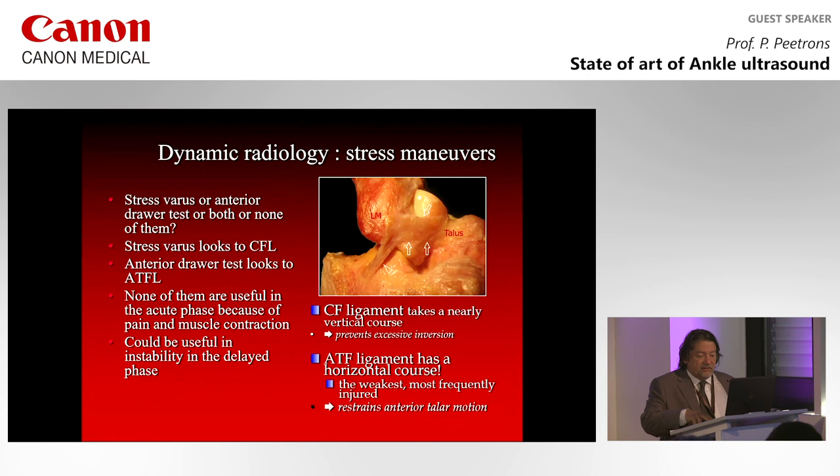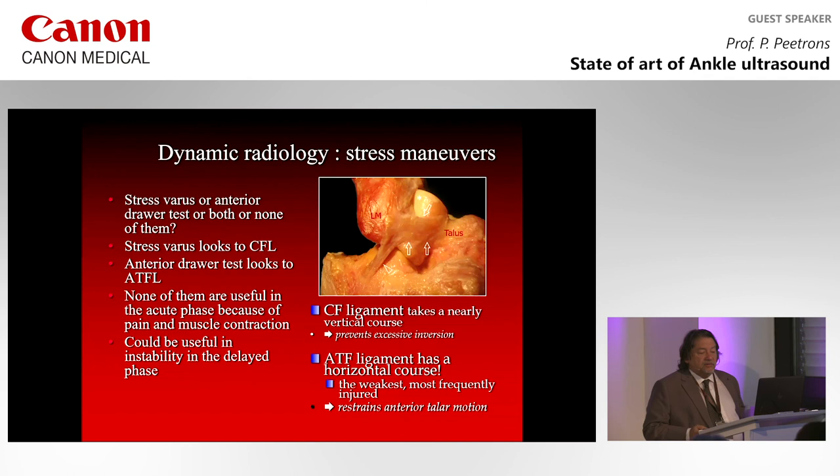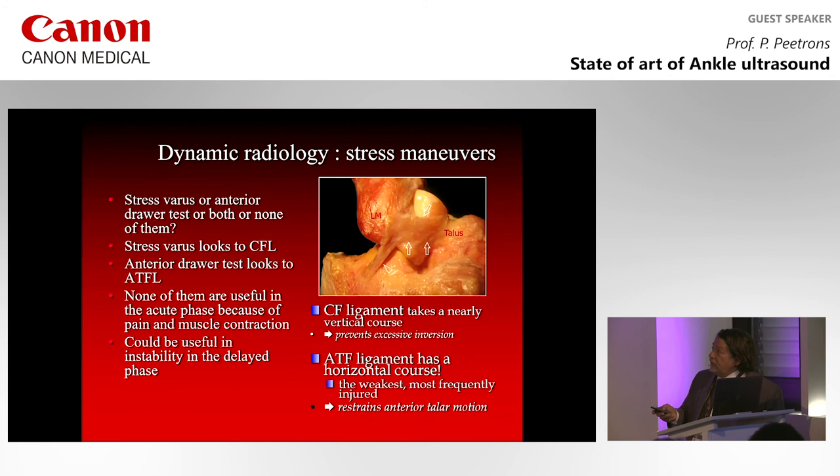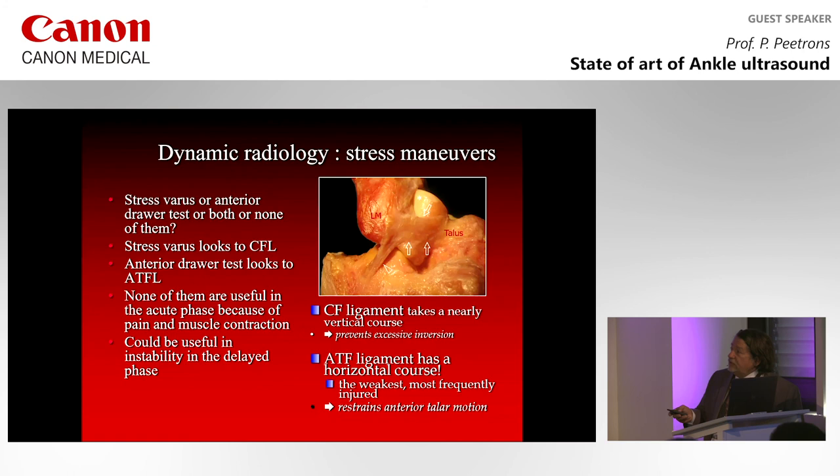So I will show you now the stress maneuver that we can use to see the lesion of the ATFL. Can I have a model now? And you all know that stress varus looks at the CFL, and the anterior drawer test looks at the ATFL.